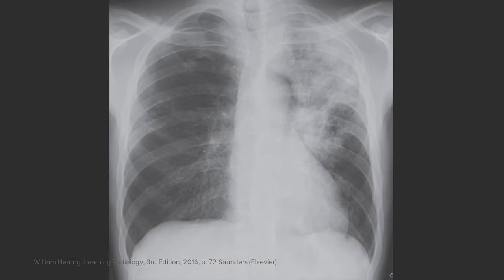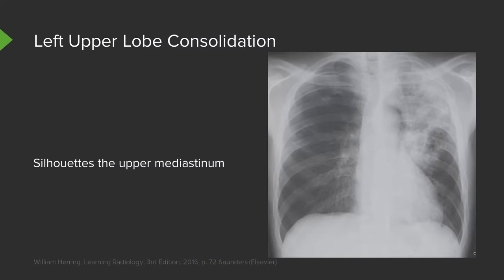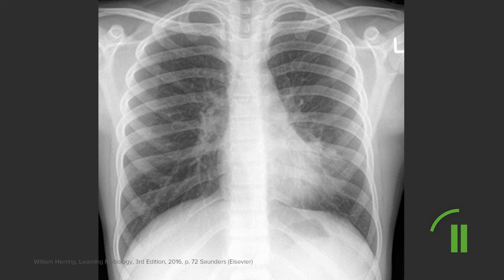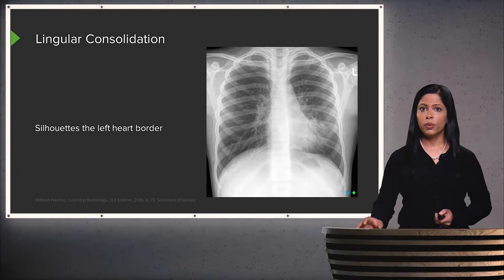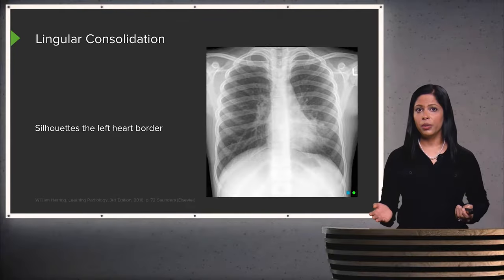This is an example of left upper lobe consolidation, which silhouettes the left side of the upper mediastinum, and you can also see some classic signs of air bronchograms. Here we have silhouetting of the left heart border — the right heart border is clearly visualized, while the left heart border becomes hazy. This is an example of a lingular consolidation. The lingula is a portion of the left upper lobe located in the same anatomical position as the right middle lobe, though it is considered part of the left upper lobe.